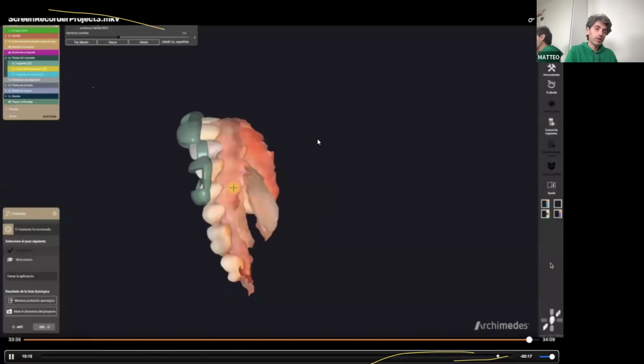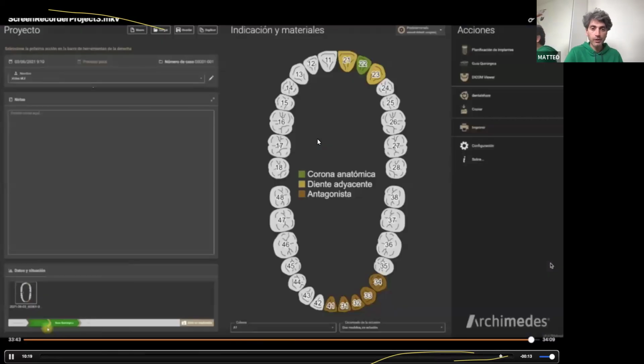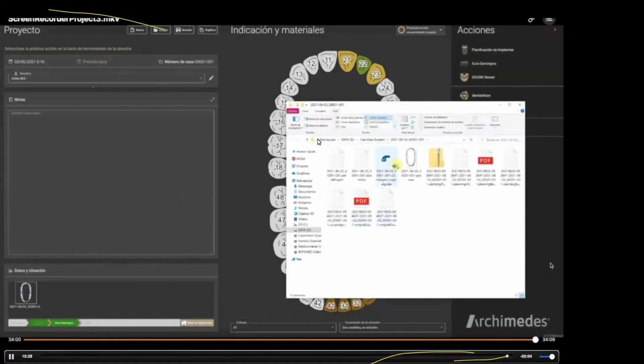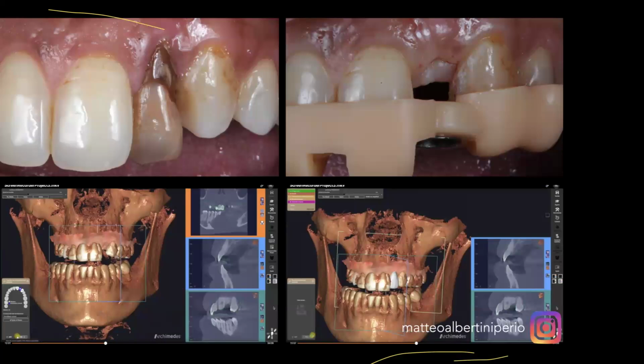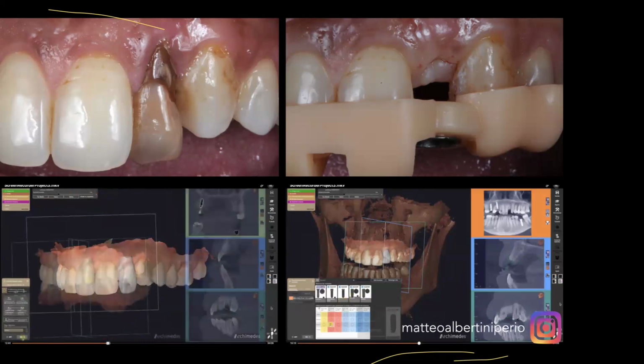And with the printed solution, you can do it chairside. Да, и дальше у вас есть две основные опции, как вы будете изготавливать хирургический шаблон. Можно напечатать его на 3D-принтере или отправить в большую лабораторию, в фрезеровальный центр, где вам его отфрезеруют. Но, должен сказать, фрезерованный хирургический шаблон отличается большей точностью.